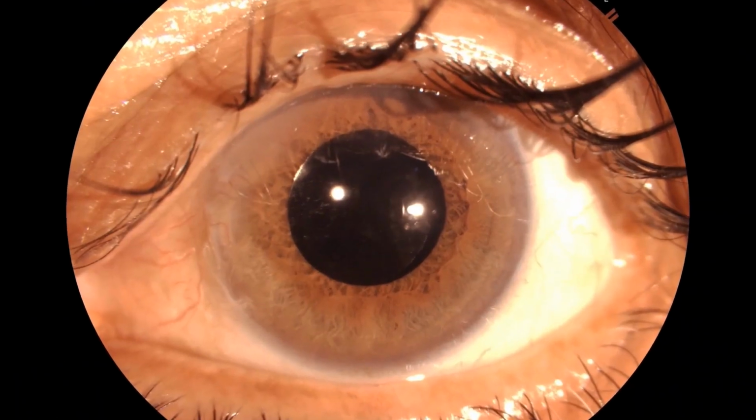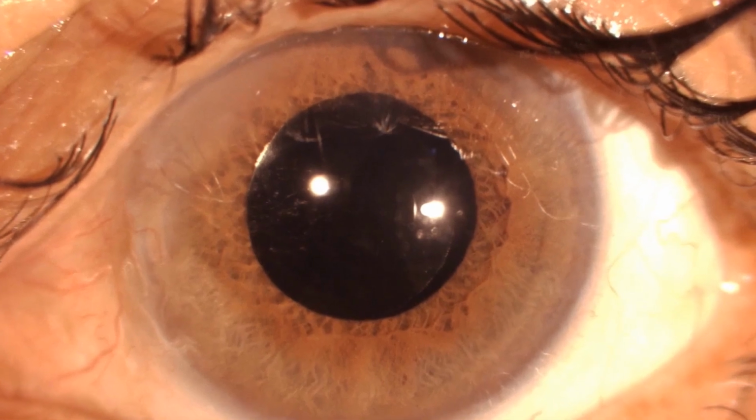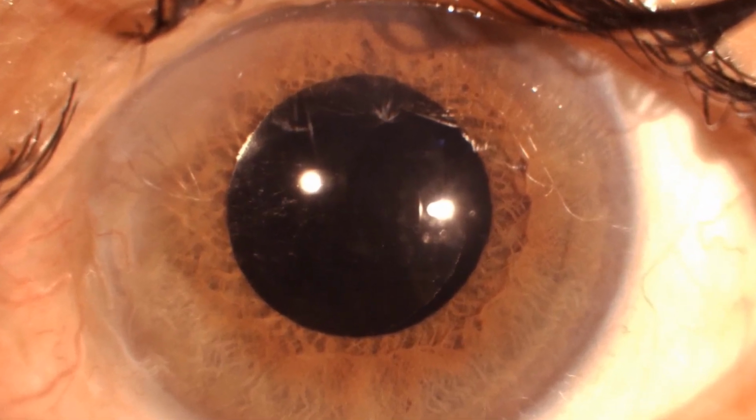And this is the patient at day 1 post-op, where we can appreciate a clear cornea, a centered IOL, a pupil which has been dilated using a mydriatic, and a visual acuity which was 6 by 12.